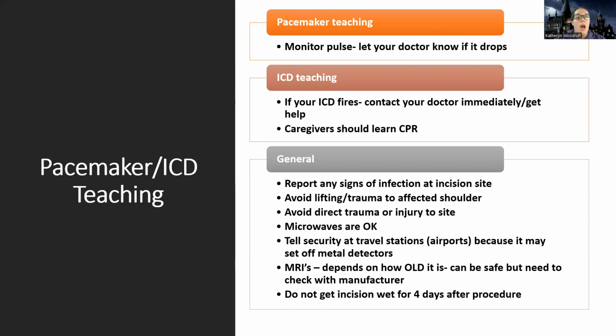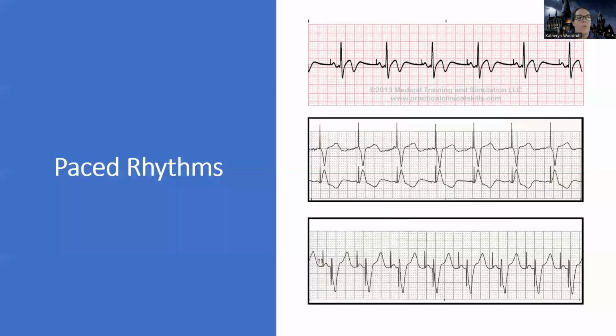Let's try paced rhythms. So we just finished talking about pacemakers. Now we're going to get into paced rhythms. Like I mentioned at the beginning of this lecture, you do not have to know in depth all the different issues that can happen with pacemakers, like failure to pace, failure to sense, failure to capture. But you do have to be able to look at a strip and identify that it is a paced rhythm.